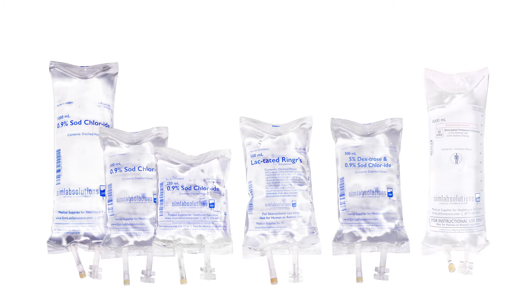SimRx simulated IV fluids are available in a wide variety of saline, dextrose, lactated ringers, and potassium solutions to help students distinguish between various types of IV fluids.